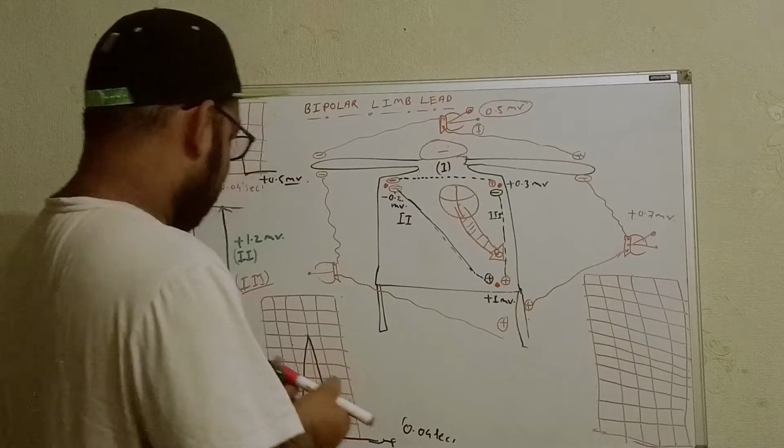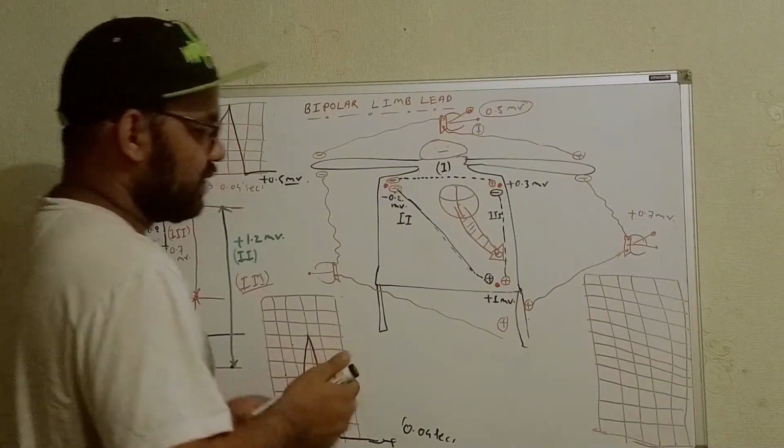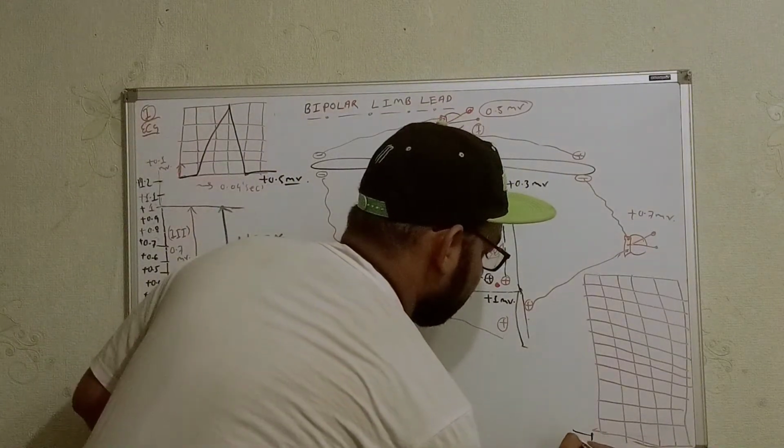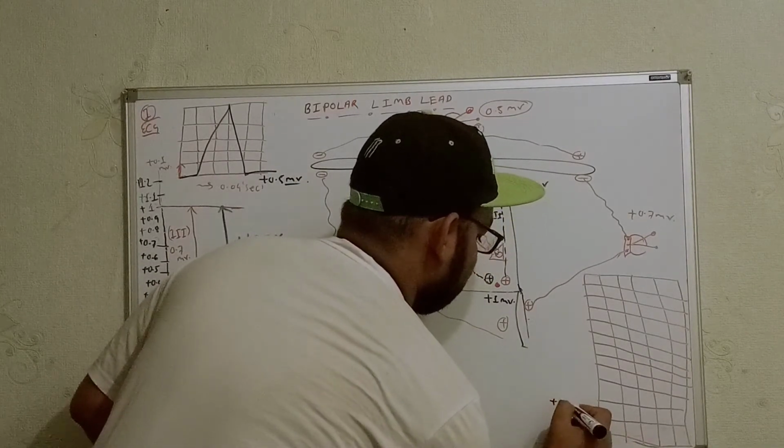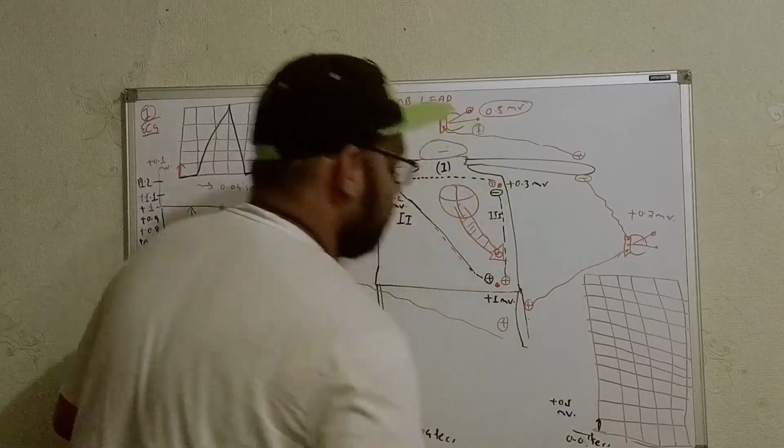Now in the same way, we have to consider that in this direction we will get almost 0.04 second, and in the vertical direction we will get almost plus 0.1 millivolt. Plus 0.1 millivolt. Okay.